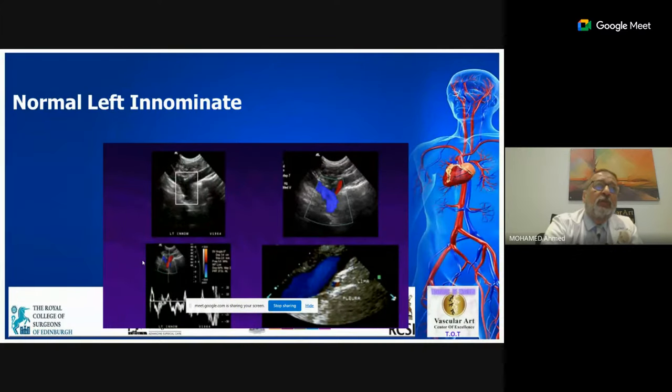If you are going to do endovascular arteriovenous shunting, then you must see the relation between the ulnar vein and ulnar artery, and are they far away from each other or very near? Is there a perforator that can connect it to the superficial system in order for you to have an access? And shall you do it on the ulnar vein and artery, or is the radial vein and artery better? All this information, you grab it by duplex.